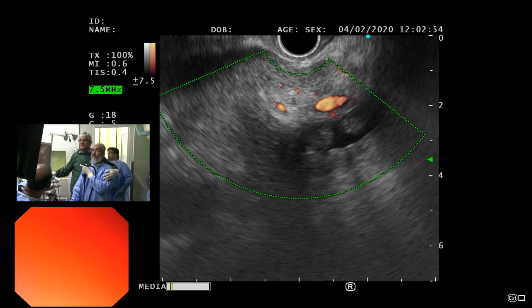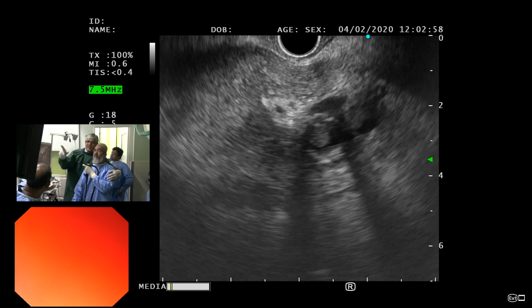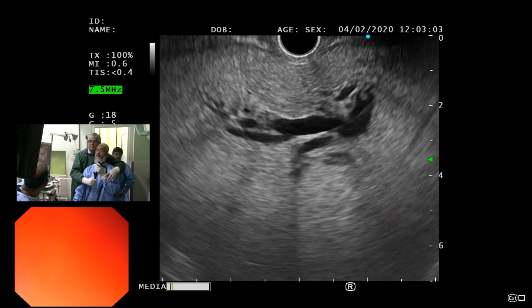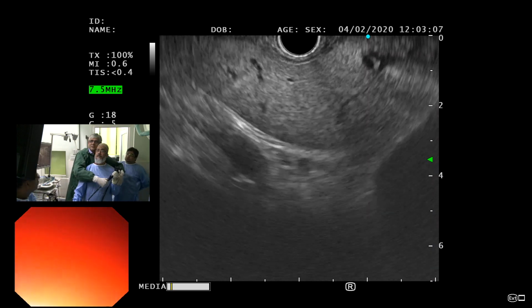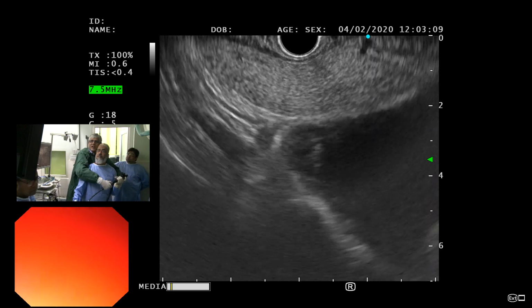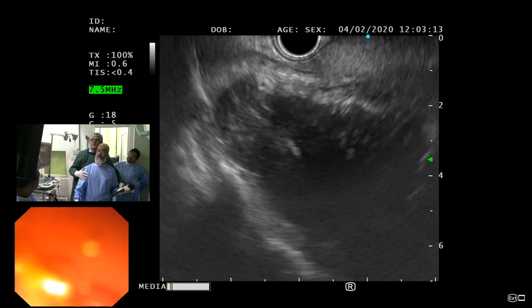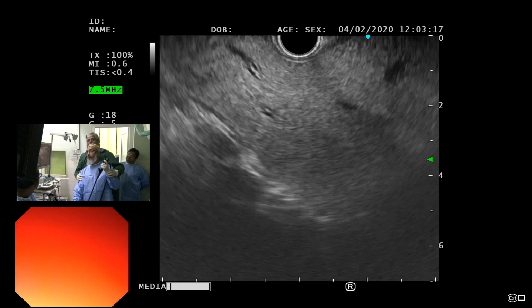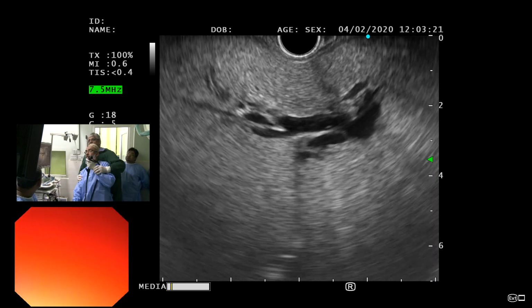Is this thrombus there? No, this is obviously dilated ducts with some debris in it. So if you want to scan the liver, you keep rotating yourself, keep rotating, and your hands going down, down, down. You've gone all the way. Now you can actually do the same thing again slowly, and you should be able to see if there is anything there. Certainly you can see debris in the ductal system.